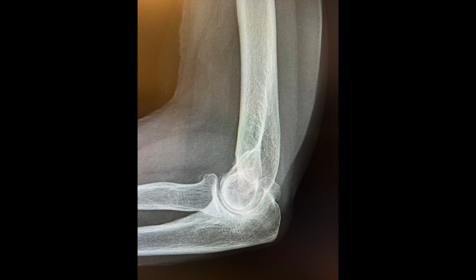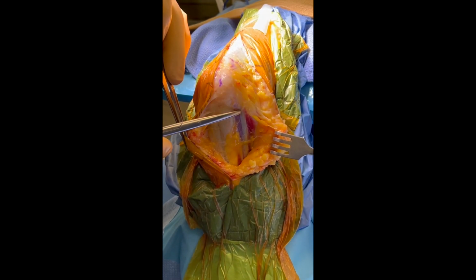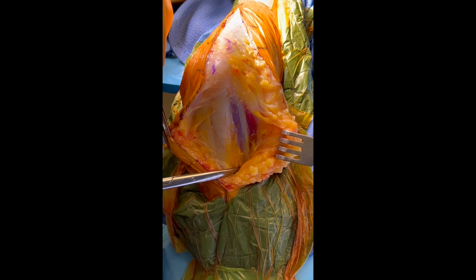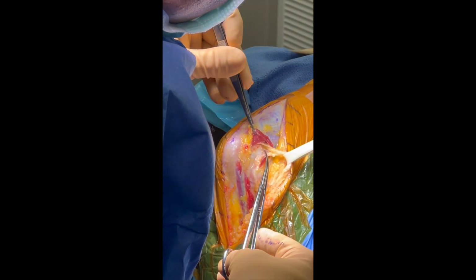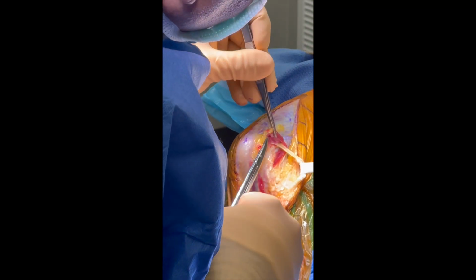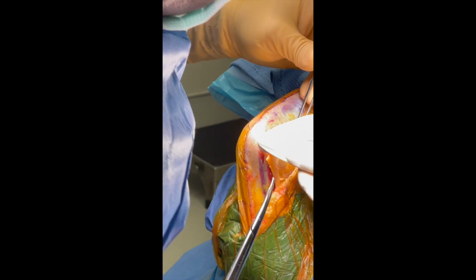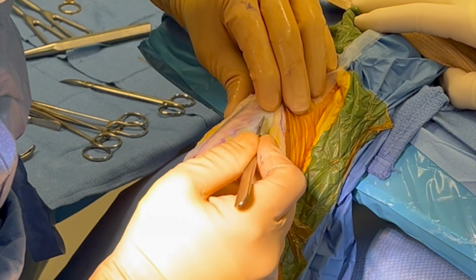The patient is placed supine on the operating room table with the arm over the chest over a padded Mayo stand. A midline incision is made, and the ulnar nerve is found medial to the triceps. The ulnar nerve is protected throughout the case with a vessel loop. It is dissected out of the cubital tunnel and placed into a subcutaneous pocket.